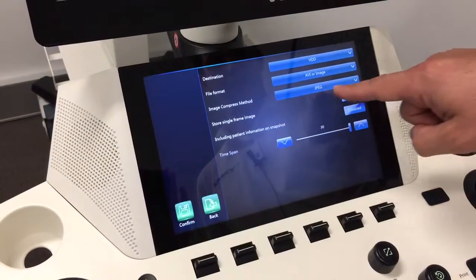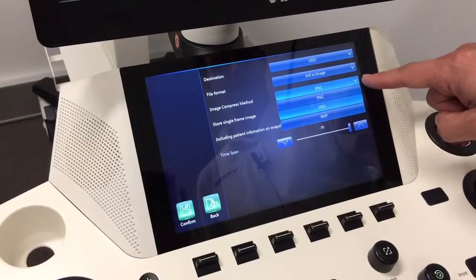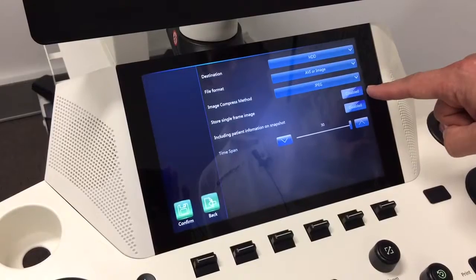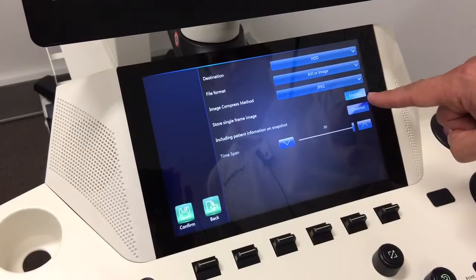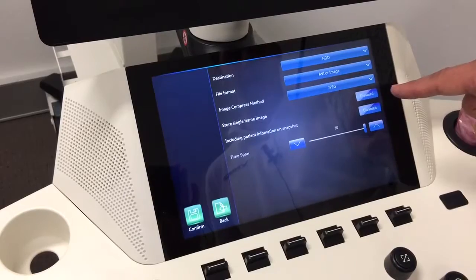The image compression mode, we've kept it as JPEG. You can also choose PNG or bitmap. And store single frame image, that's disabled at the moment. If that's enabled, what will happen is even if you're playing back a video file, it'll only save a single image. So keep that disabled if you want to be able to save both pictures and videos.